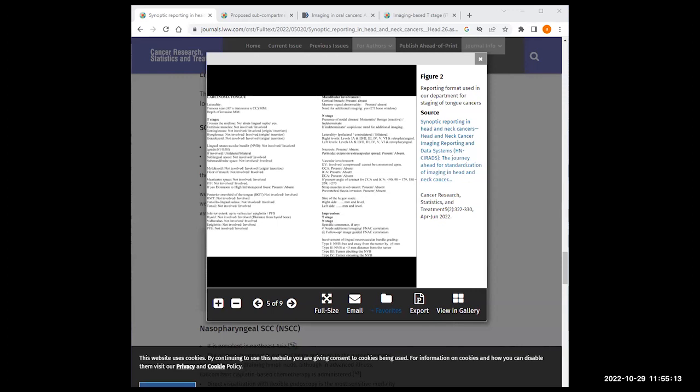Yes, sir. So I've shared with Sarita a few of the links for the articles which I suggested if you need to read further about tongue carcinoma. I'll just run you through the reporting checklist in the next couple of minutes. You can use this template, which is available from the article online. It makes reporting of the oral tongue very easy.